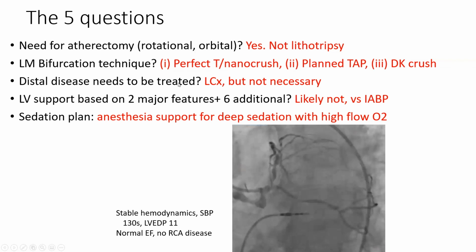Does he have distal disease that needs to be treated? He has circumflex disease, but it's not absolutely necessary to fix it, as I will show in a little bit. And that will increase your hemodynamic complexity if you try to fix it.